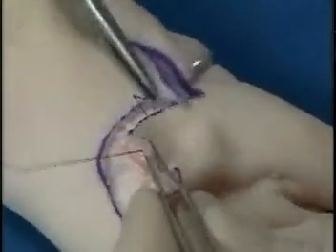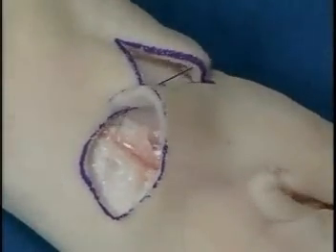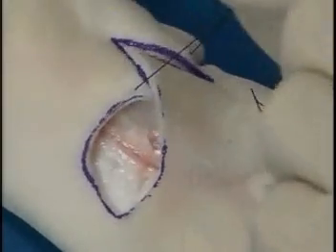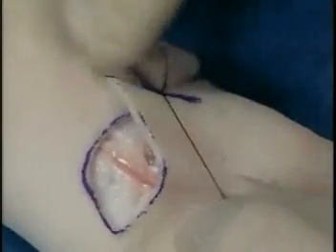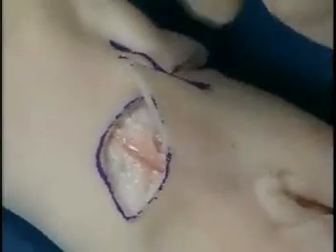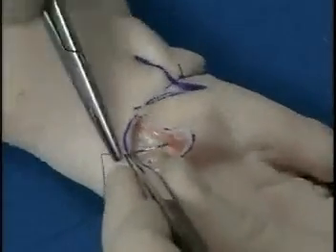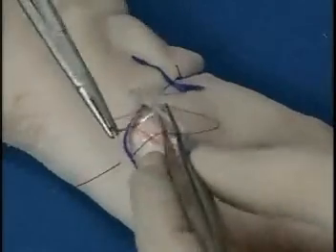Now, the first suture is being placed, as we see in this example, from the apex of the flap, from the tangent of the circular defect. That's the point of maximal tension. The second suture is now placed. It's placed at the flap as it's being rotated into position.